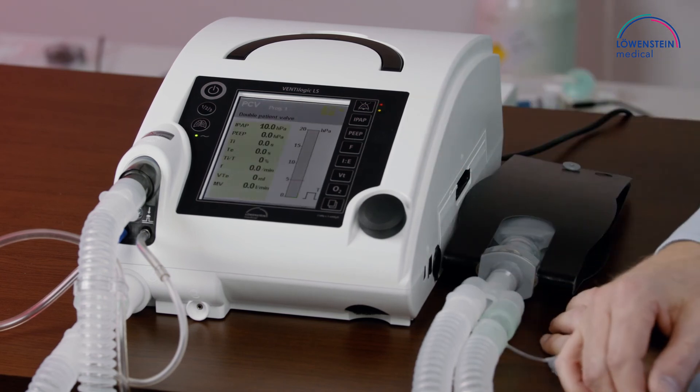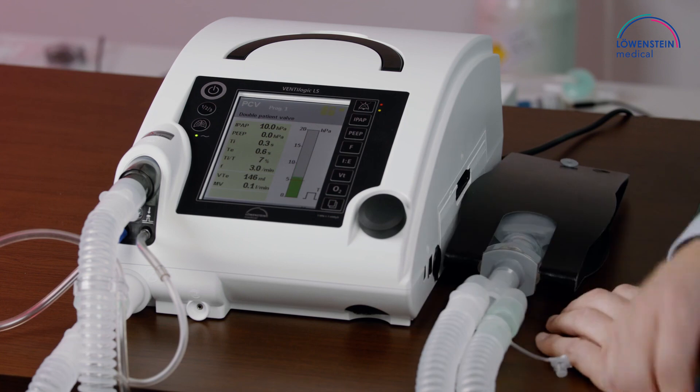On the display, we can see all the important information for this ventilation.